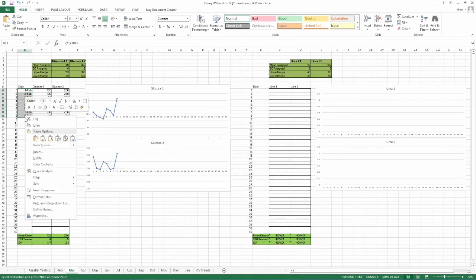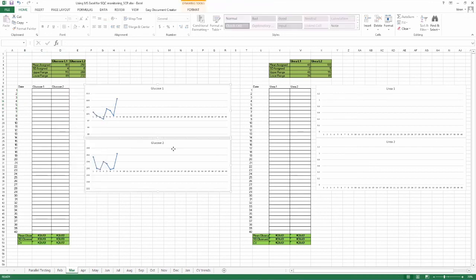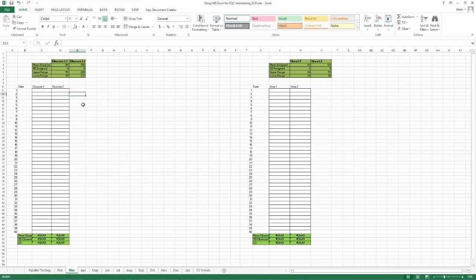Clear contents with regard to data inputs and dates from each parameter. Delete graphs and start afresh. The assigned values will stay the same as long as the lot lasts. The calculations of the observed mean, SD, CVs will still be available. However, regraphing will need to be done as explained earlier.